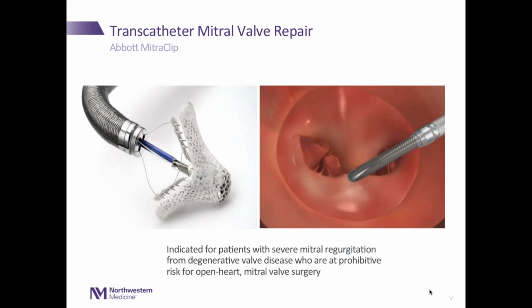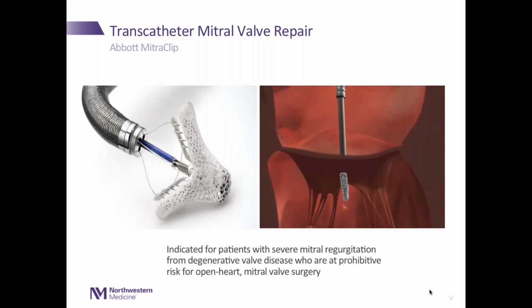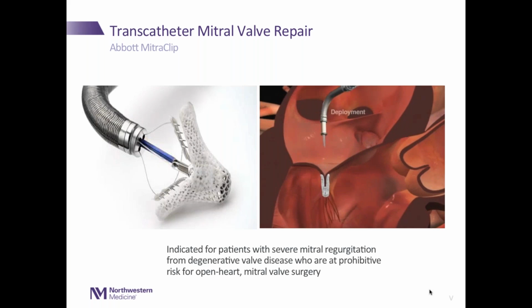This is a completed mitral clip procedure with a clip right down the center between the two leaflets, successfully reducing the mitral regurgitation. Next slide.